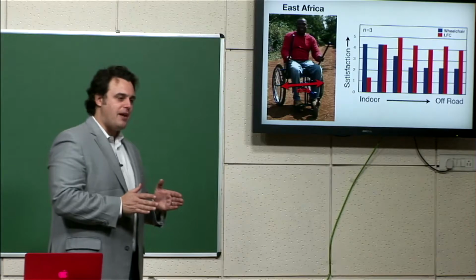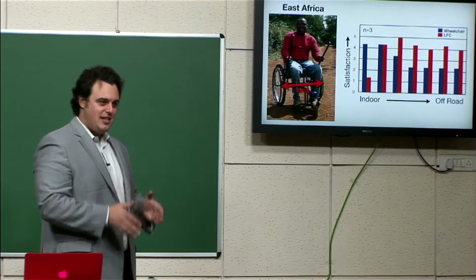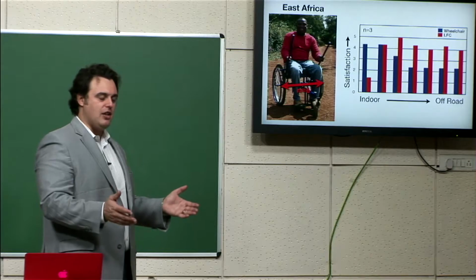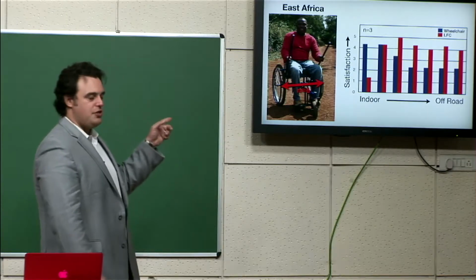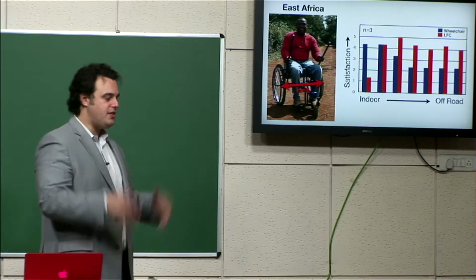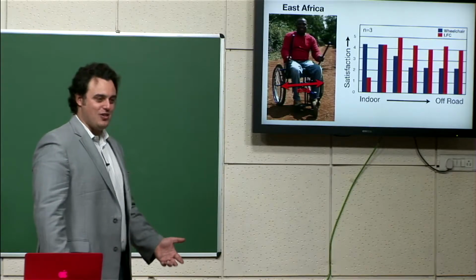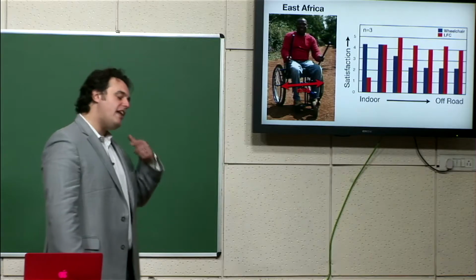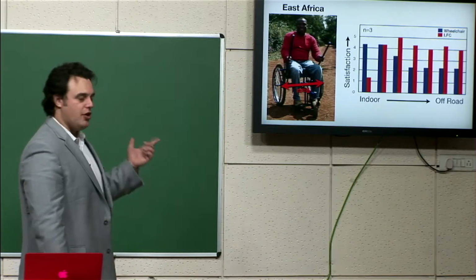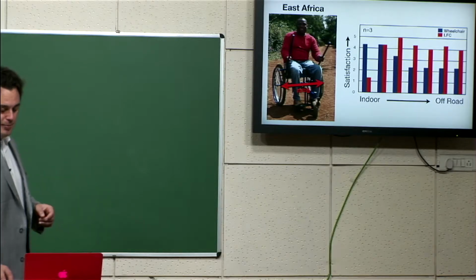But we forgot about this secondary requirement that a wheelchair is a chair that a person sits in like 16 hours a day. And for most of that time, they're not traveling any long distances. They're going to use our lever system maybe 1 or 2 hours a day if they have to go some long distance. As soon as they get indoors, they'll take the levers off and just grab the push rims. And when that happens, they need to get indoors. They can't stay outdoors the whole time. So we had not realized that important secondary requirement and had made a chair too wide accidentally. But we found that out, and we were able to address it in the upcoming prototypes.